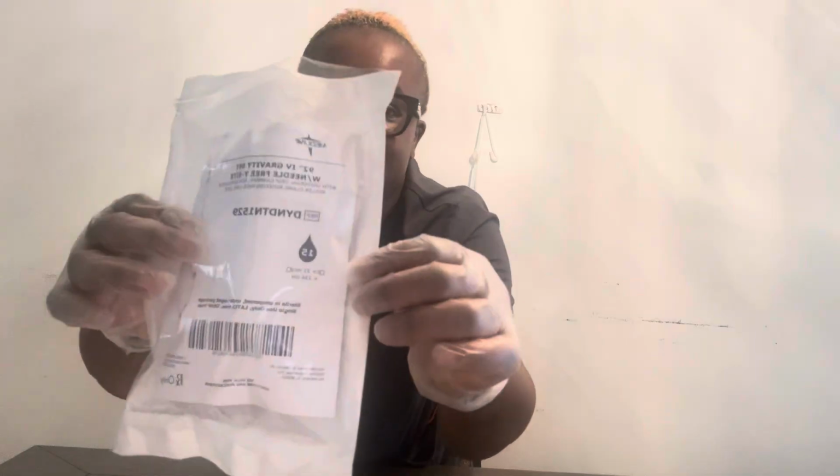For our primary tubing, I have a macrodrip drip set that is going to be running at 15 drops per ml, and I have my piggyback, my amoxicillin. I have my amoxicillin, I'm sorry.